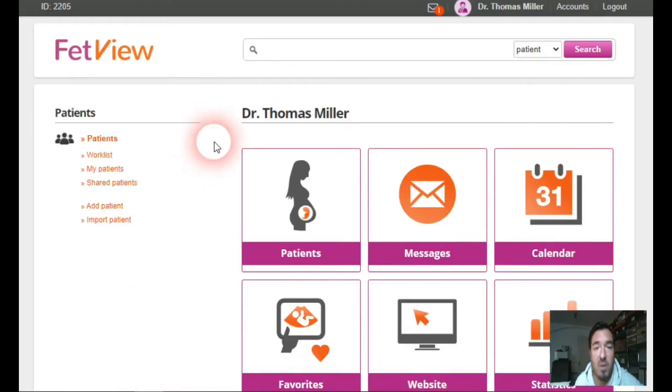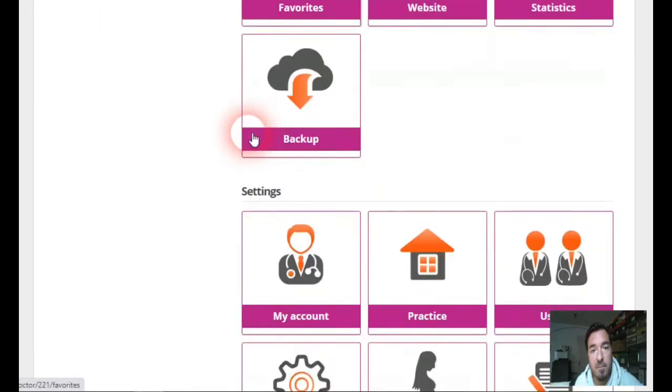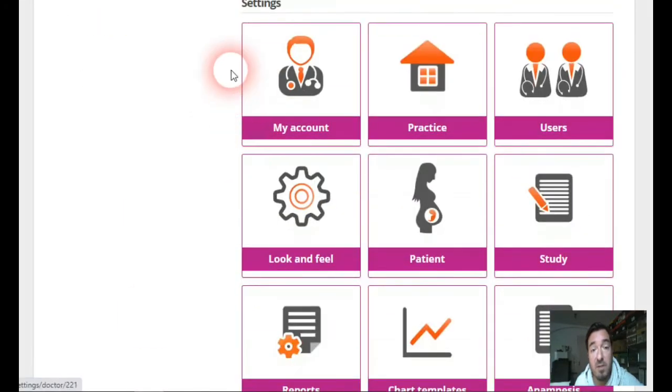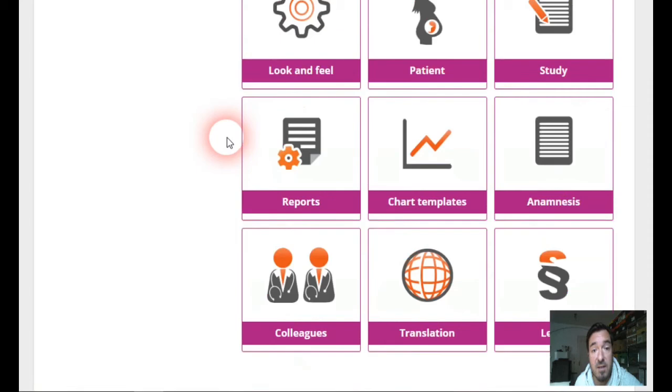Another field where we can customize it, again we scroll down to settings, is the field reports.